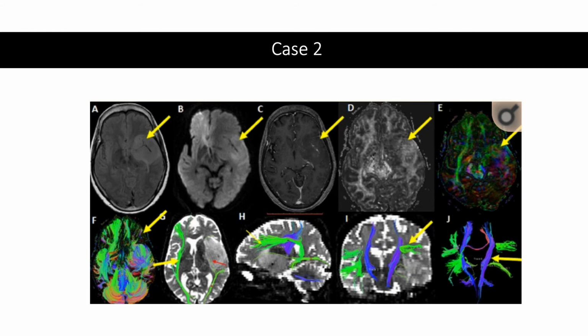Imaging that was taken for another case, case 2, is shown below. In this case, a 34-year-old female was used that had developed partial epilepsy with transient language disorder. MRI initially showed the left insular lesion characteristic for low-grade glioma.